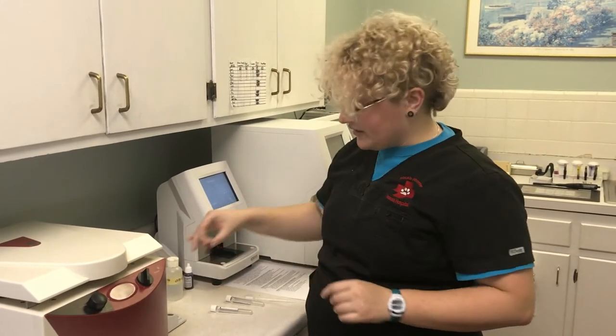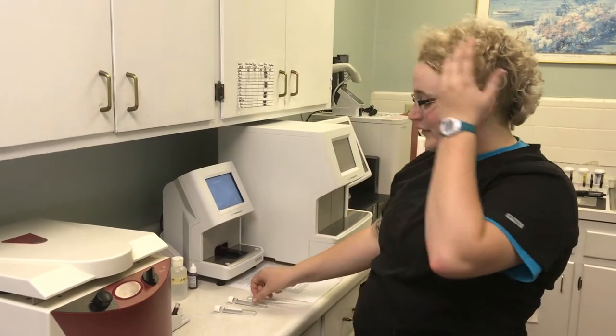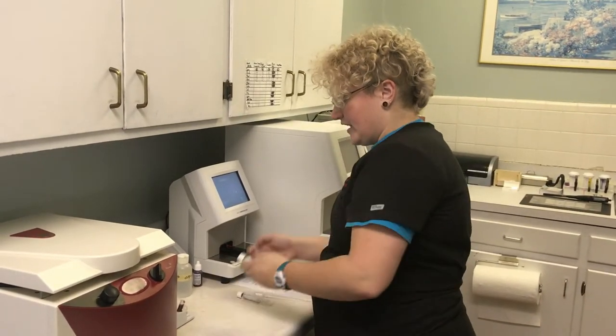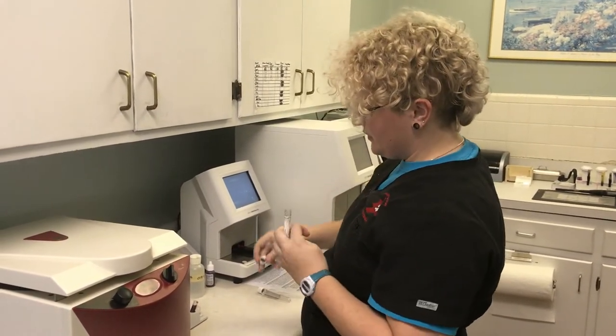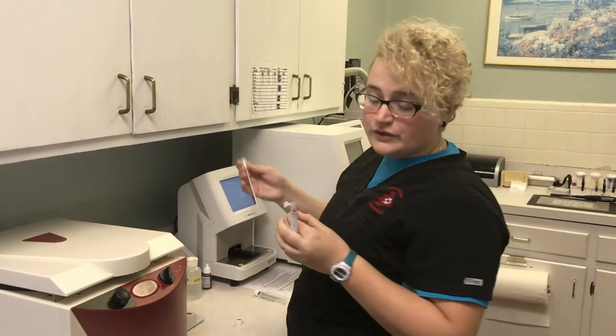First things first, I have 1 mL of blood anticoagulated with heparin. The first thing I'm going to do is pull 1 mL of my anticoagulated blood and place it in the centrifuge tube.